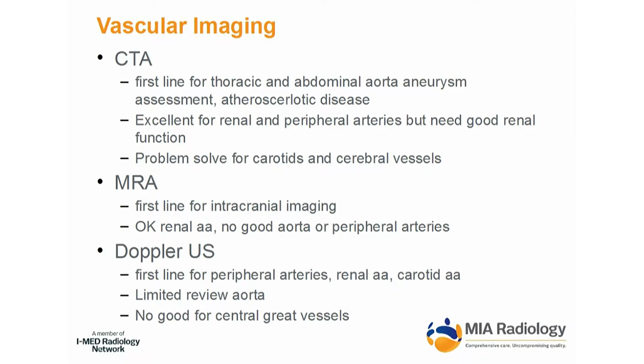MRA, great for the brain arteries, and I would say if somebody approaches you, they have a family history of aneurysm, or you're thinking you want to just have a look at the vessels of the circle of Willis for some reason, MRA is the first line.